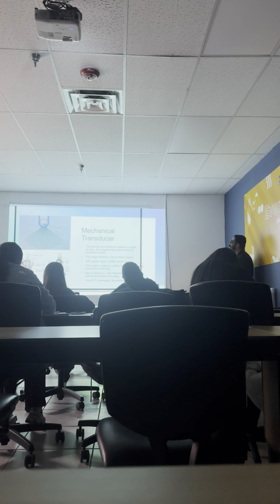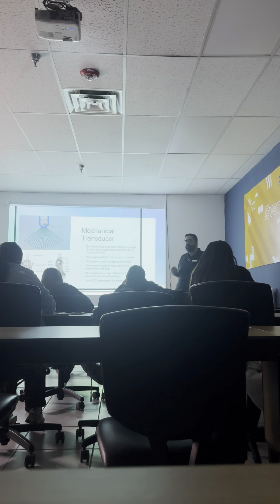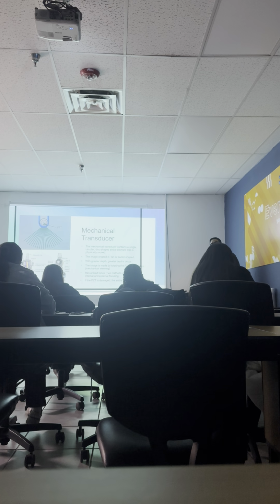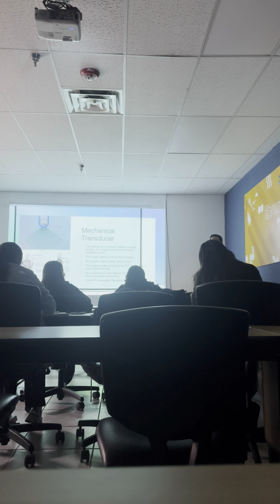Okay, so we have mechanical transducers. In DMS, do we use mechanical transducers? No. What do you think is mechanical about it? What does mechanical mean to you? When you think of mechanical, what do you think? Like moving parts.